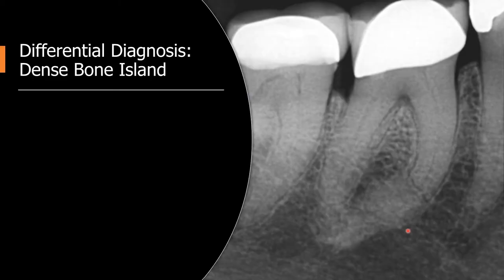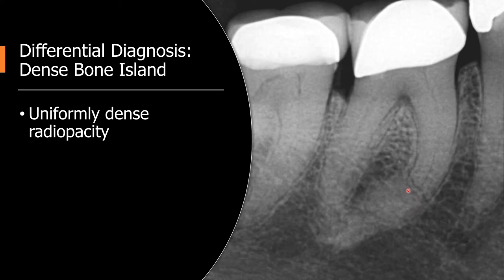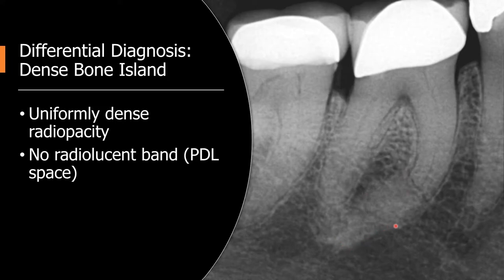Let's review dense bone island. You may easily identify a dense bone island based on its radiographic features. Dense bone island or idiopathic osteosclerosis is an area of uniform density. This radiopacity has no radiolucent band — nothing similar to a periodontal space. As in this case, there may be some root resorption.